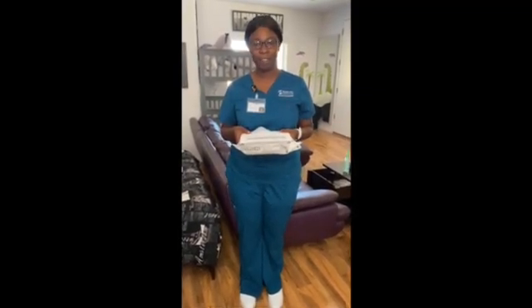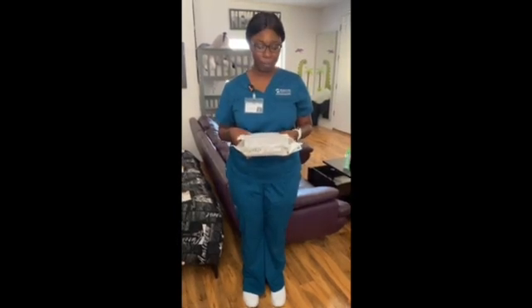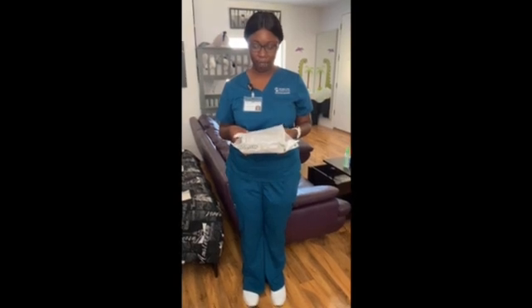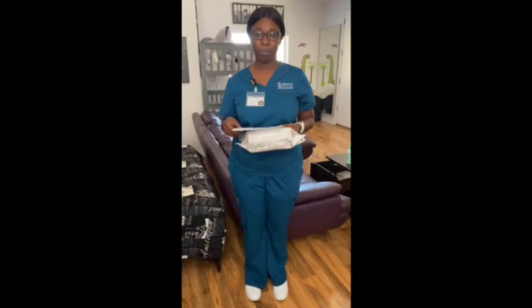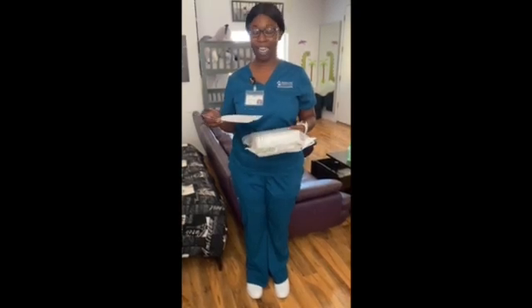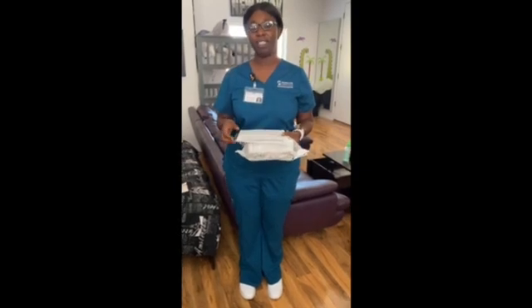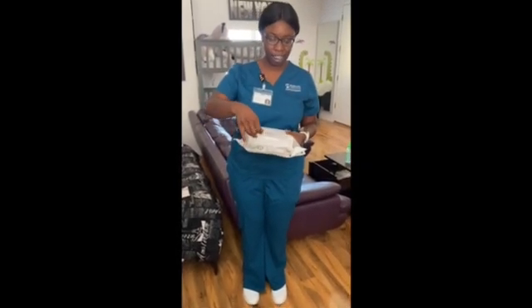My name is Monique and this is my SCC Foley checkoff video. Before I begin, I will go over the physician order for patient Cody Taylor. He would like for me to insert an indwelling Foley catheter related to her urinary retention. Before I go in the room, I will gather my materials, which is my Foley catheter kit, an extra pair of sterile gloves, as well as an extra catheter. And I just want to show my physician order.